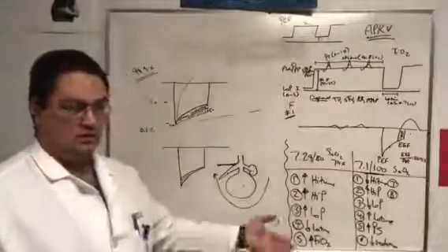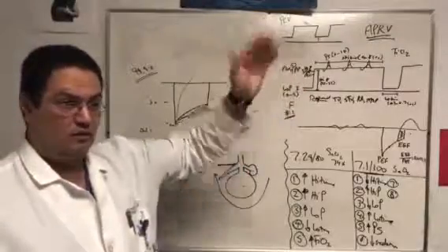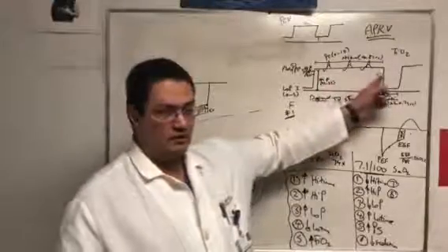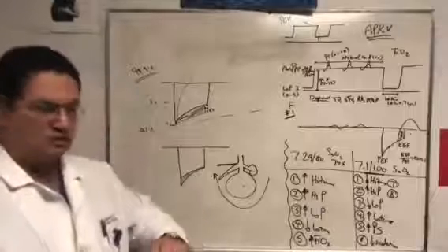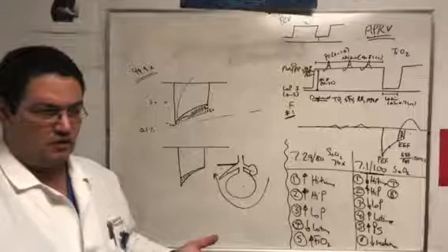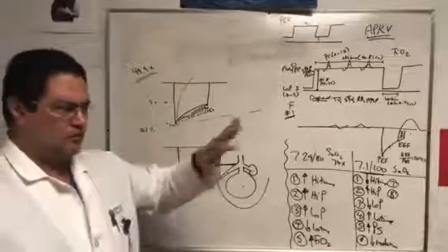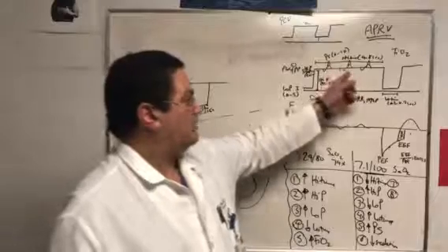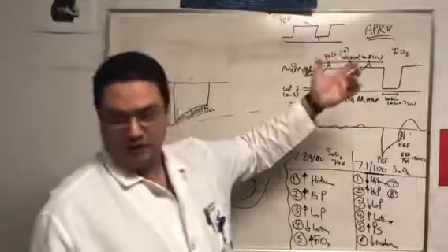This is the opposite. Another claim to fame of this mode: the worse you get, the more you decrease the sedation. Because by decreasing the sedation, there are more of those breaths, and there's more minute ventilation. So the rule of thumb, when we tell the nurses how to sedate patients with APRV or bi-level, is to look at the rest of the parameters, but in addition you have to have at least one yellow bleb on the high time. Yellow bleb meaning spontaneous breath.